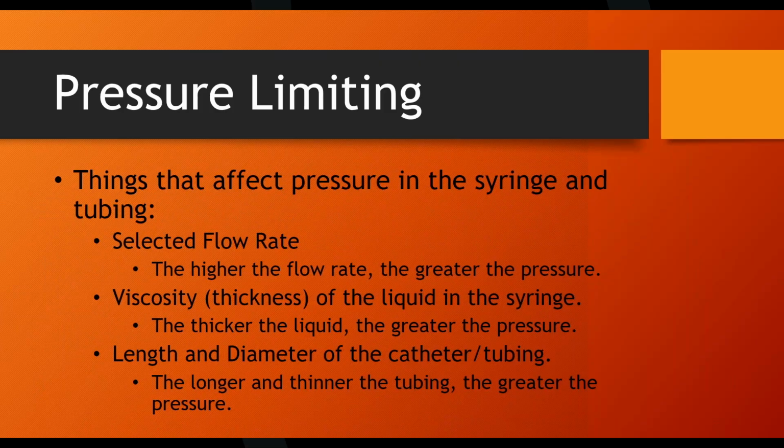People will ask, why is there a heater for the saline fluid? Saline's water, and warming it up doesn't lower the viscosity at all. But there are a lot of options where they'll shoot the two fluids together, a diluted version, where they'll shoot a little bit of saline, followed by contrast, followed by saline. Well, if the contrast is at 37 degrees Celsius, or 98 degrees Fahrenheit, body temperature, and the saline is at 70 degrees room temperature, it'll cool it off, which defeats the purpose of warming it up. So they'll keep the fluid in both syringes warmed up if they think that might be an issue. All right.